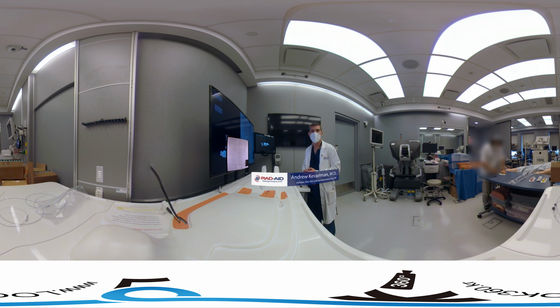So for the first step, again, we're going to introduce a 5 French base catheter. For the first portion of this, I'm going to use a C2 catheter. It's a Cobra 2 catheter and a normal 035 wire. So we do have right groin access with a 5 French sheath. I'm going to introduce the catheter and the wire now through that access. And you're going to see it come up on our screen.